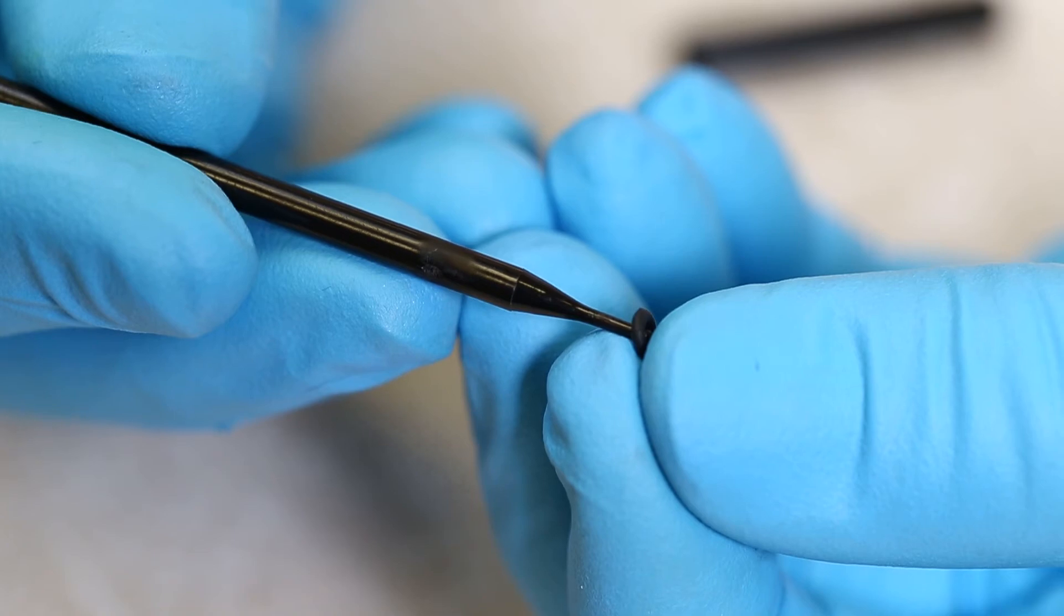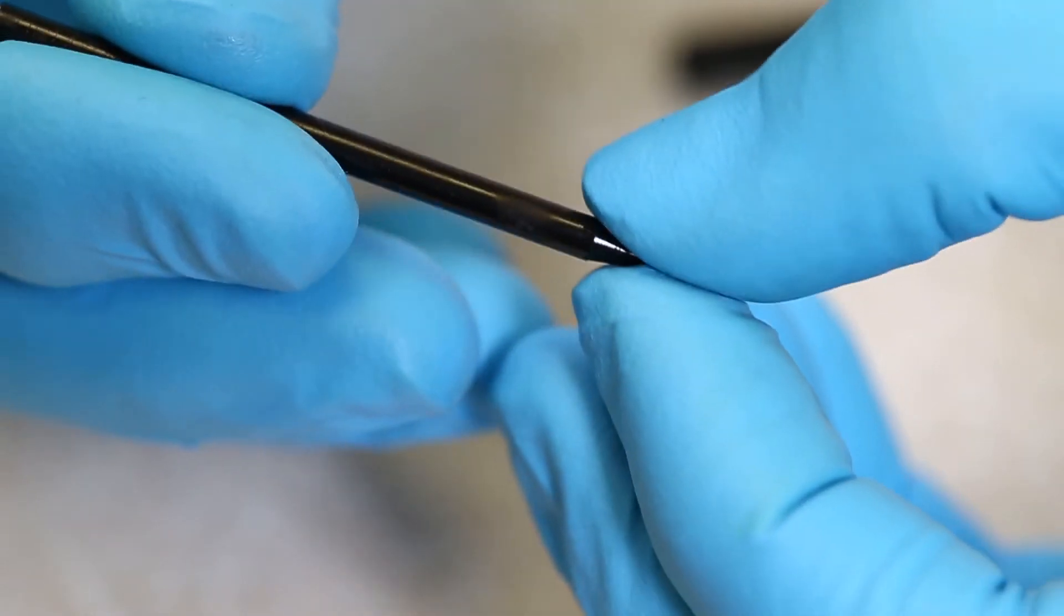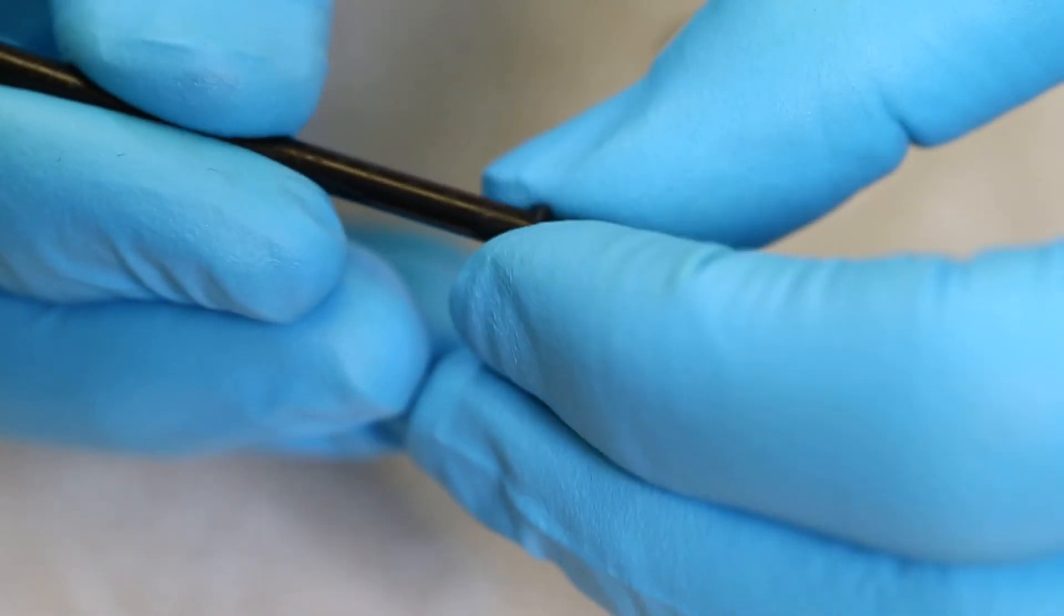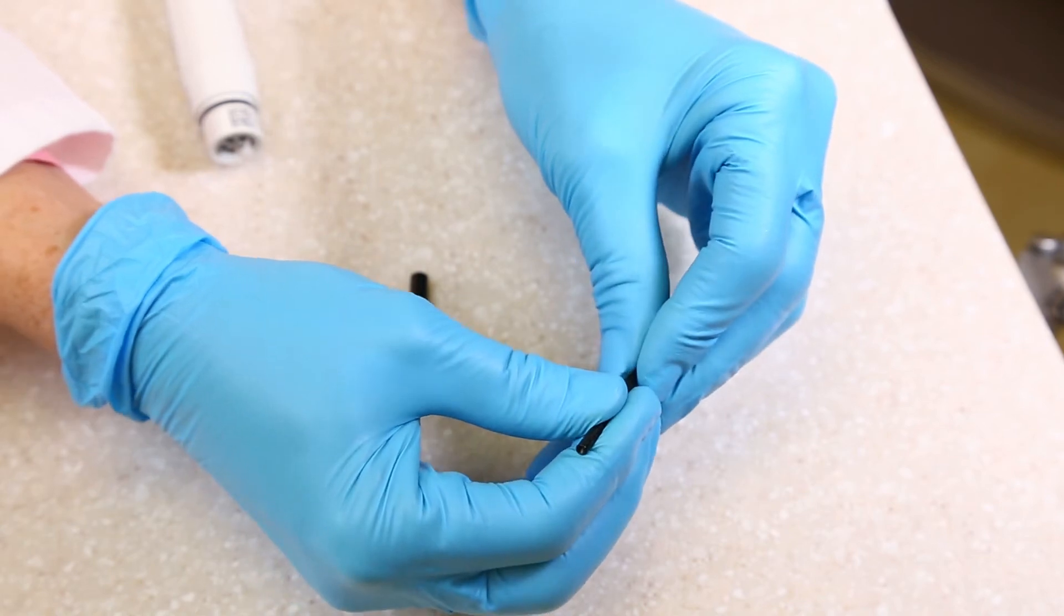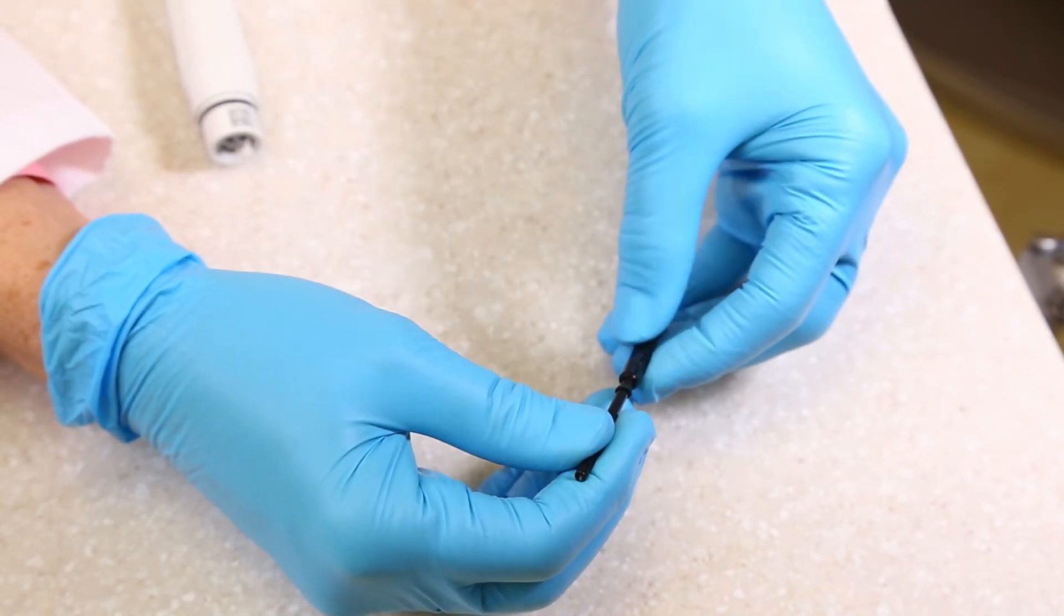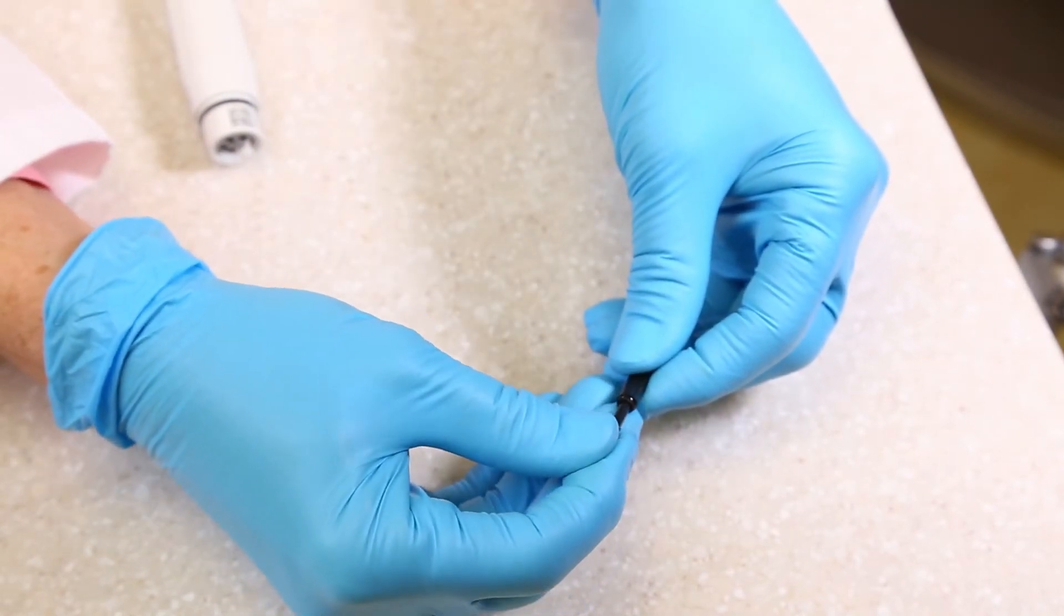Place the new O-ring on the pointed end of the thin plastic rod. Slide the O-ring to within 6 millimeters of the opposite end. A drop of oil may be helpful in sliding the O-ring.